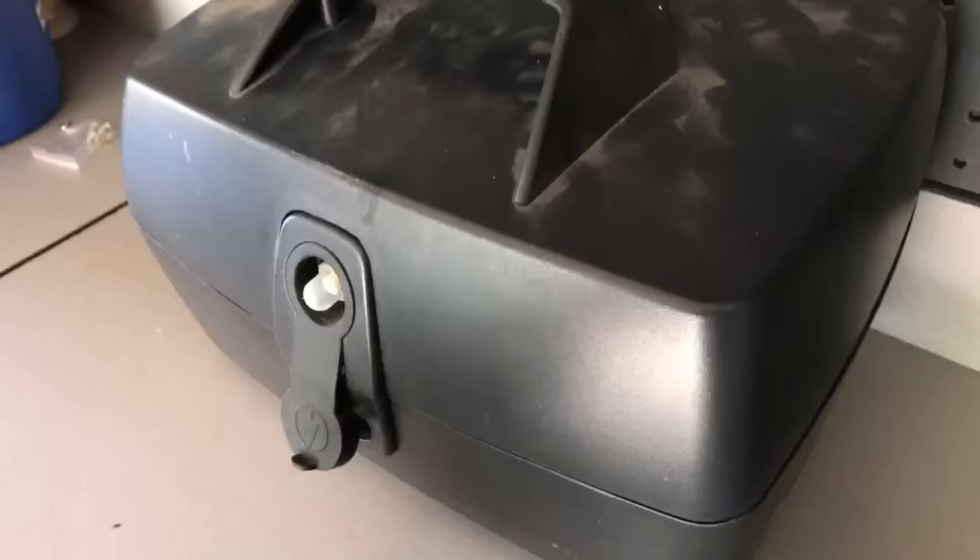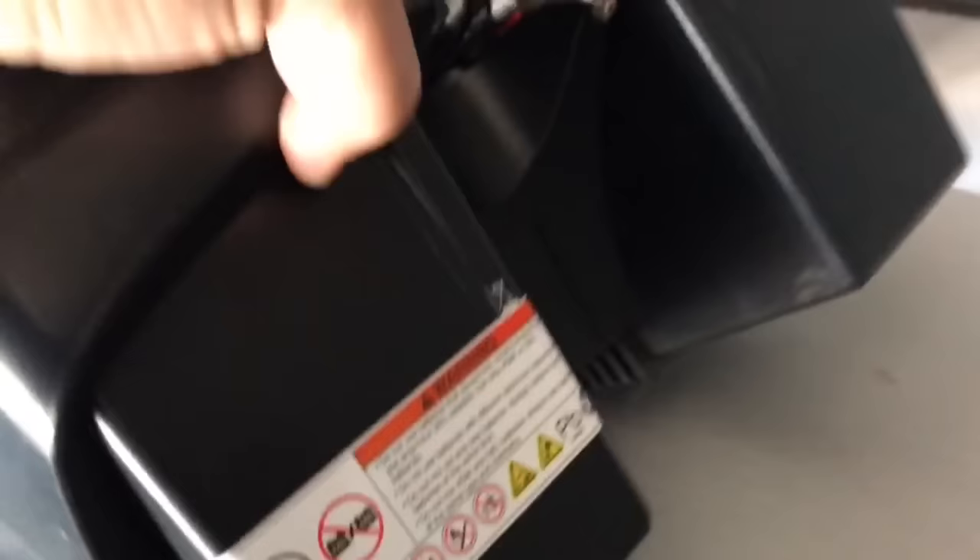The battery box lifts up — it may be a little bit hard to lift since there's velcro at the bottom, so it may sound like it's ripping. Just pull up firmly and it'll come out. On the bottom of this battery box you'll see areas where you can take out some screws. You'll need a slightly longer than normal Phillips head screwdriver.